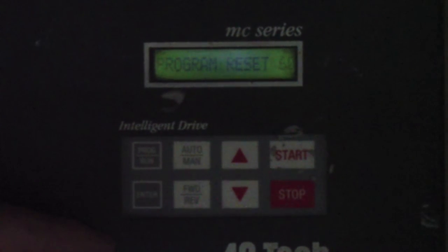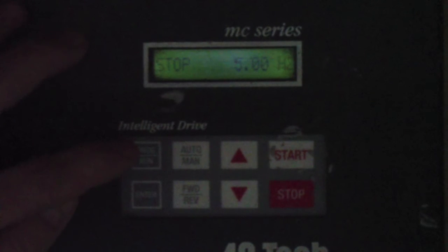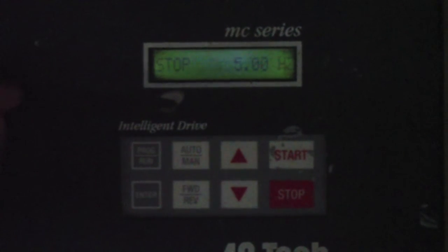Go ahead and hit Enter. The cursor comes back to the left. Then hit the Program Run button, and it'll take you back to your stop screen. That procedure will go ahead and reset the AC-TEC controller back to its default settings as it came out of the box.